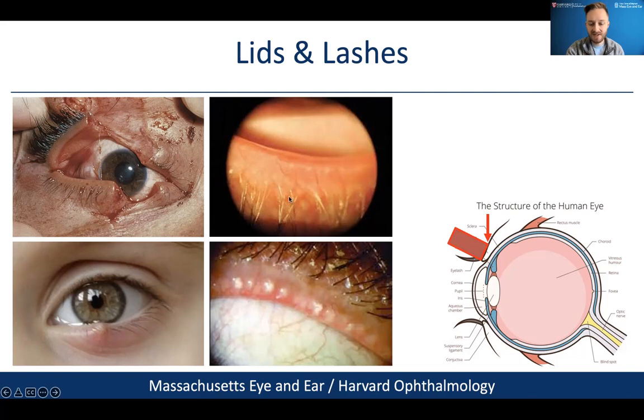An example of what you're also looking for is looking at the eyelid margin, right at the edge. Now, everyone has little tiny meibomian glands that secrete oil onto the eye. When they're healthy, you shouldn't really see much of anything other than teeny tiny little holes here at the eyelid margin, a little bit behind the eyelashes. But if the oil gets thickened or they have dysfunction of these meibomian glands, then it gets thick and it looks like this thick oily substance. And if these get blocked up, then you get a stye. That's actually what this stye is caused by, a blockage and backup of oil inside the eyelid.